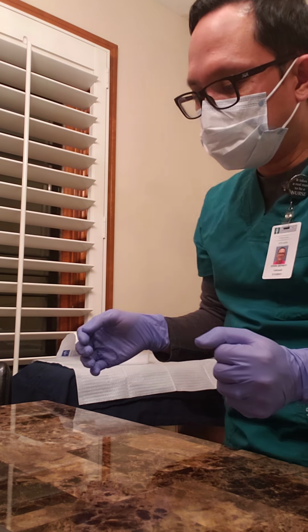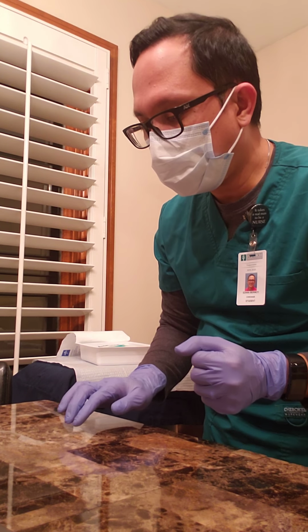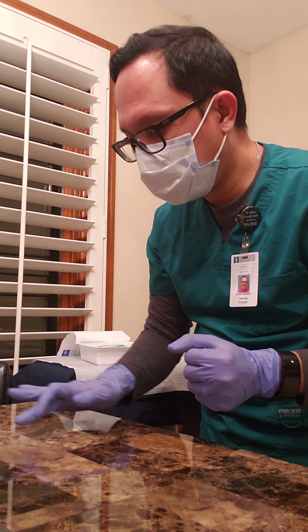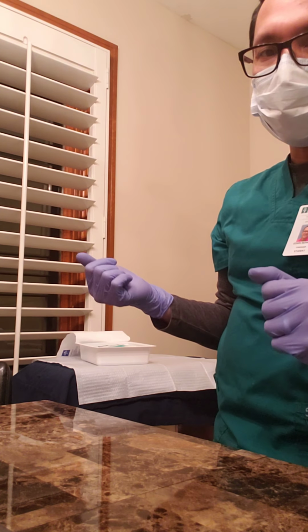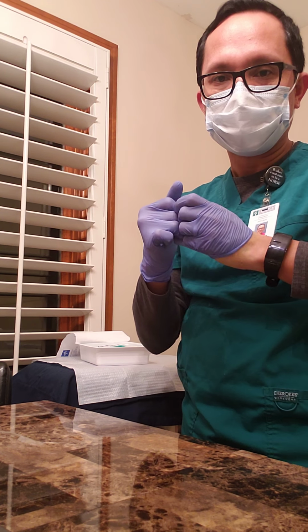After you've taken all the dressing out, you want to make sure you assess the skin on the site again, checking for any redness, swelling, any drainage, and any tenderness or any foul odor as well. Then if there is none, we're now ready to clean the insertion site.